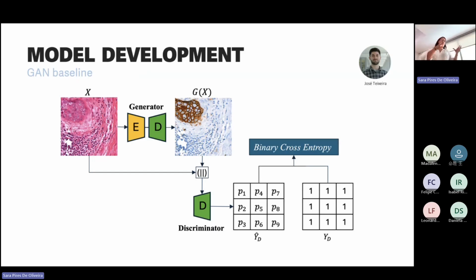That is, there's information on the morphology of the cells that is assessed on the H&E that can be used to then infer the biomarker expression. And so if we concatenate this, it's a way of trying to leverage the adversarial loss, not only to produce realistic images, but also to preserve the pathological meaning or semantics.